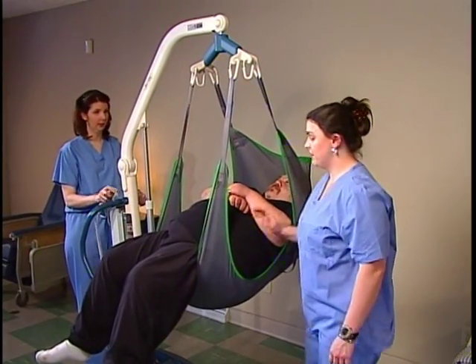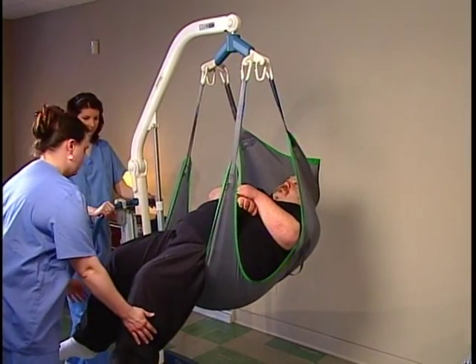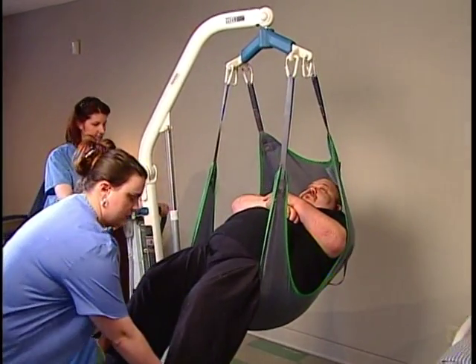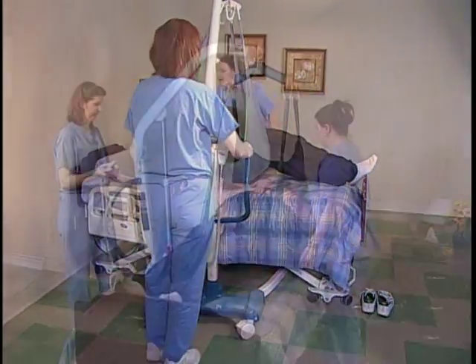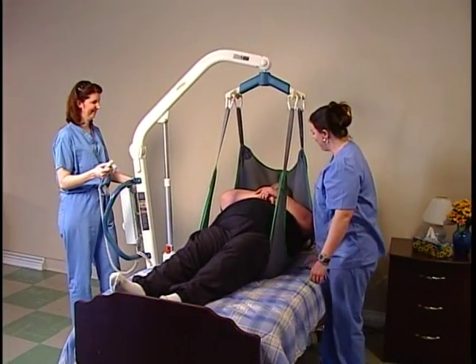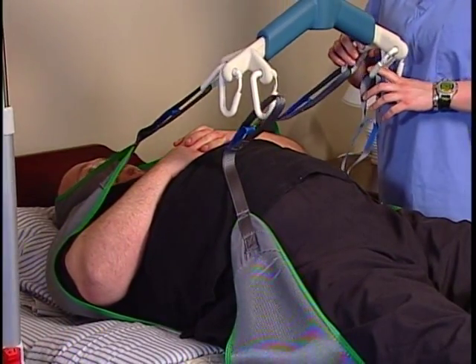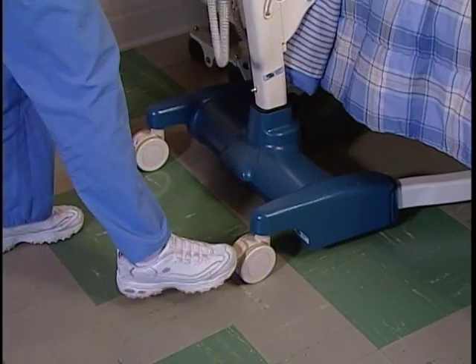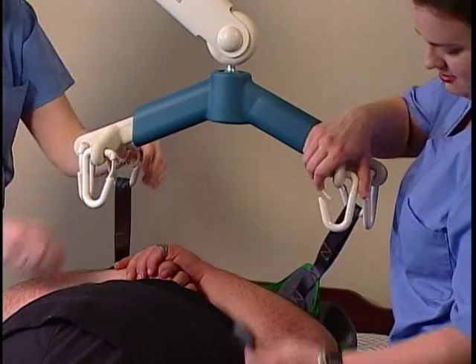While one caregiver operates the lift, the other caregiver guides the resident's knees. Be sure that the bed is at a safe working height for the caregiver. Position the resident in the middle of the bed and then lower them until their full weight is on the bed. Lock the rear casters to secure the lift. And unhook the sling from the swivel bar.